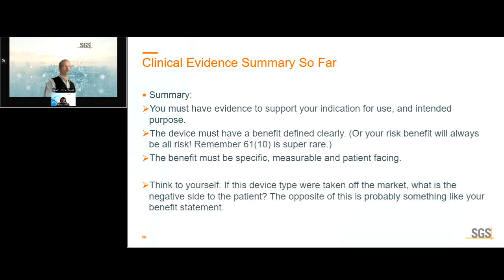So in summary, to get started here for clinical evidence, you have to absolutely have your indication for use and intended purpose, what it does, why it does it. Think to yourself the question, if the device is gone from the market, what is the negative side to the patient? The opposite of that answer is your benefit statement. Not just your device, just the whole device type. If tomorrow there were no SpO2 sensors, what's the negative? Then you find yourself knowing what the benefit is, because now you've taken the benefit away by making it not there. It must be specific and measurable. Think to that young driver telling you that they're safe.